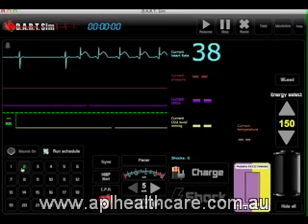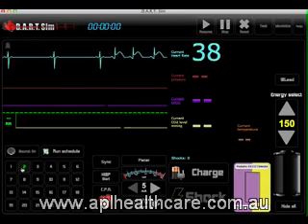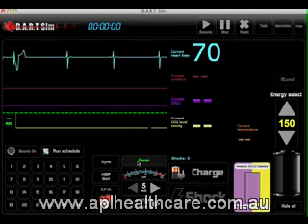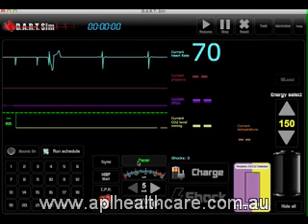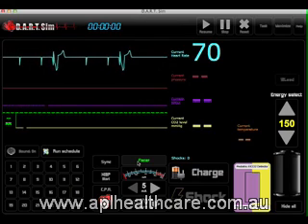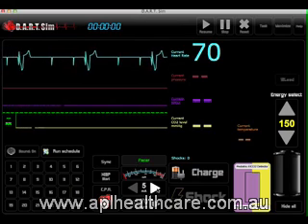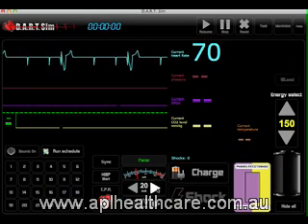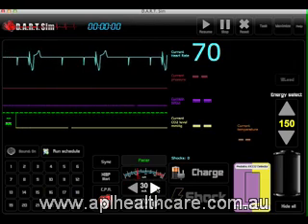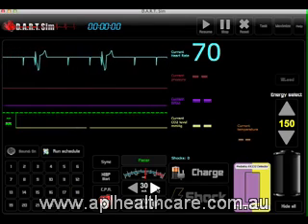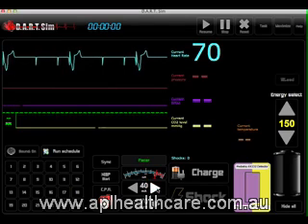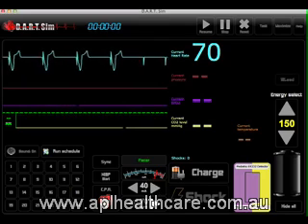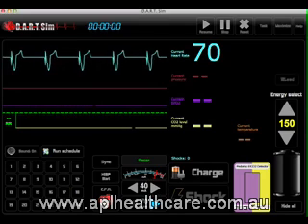We also have a pacer function. Once the pacer is activated, you then have to increase the milliamps in order to see full capture, and once you have full capture you can also adjust the rate right here below.